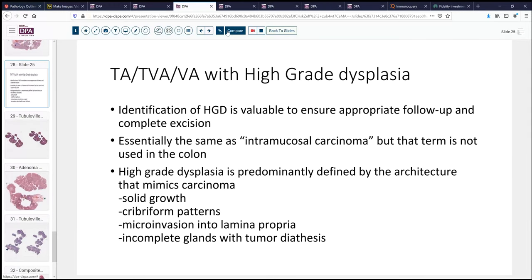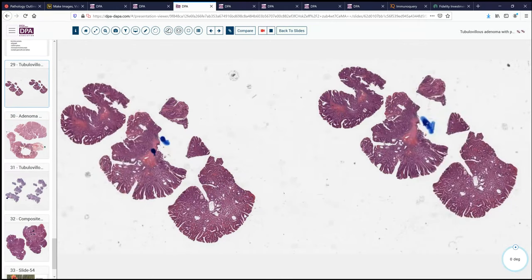Let's talk more about high-grade dysplasia. This is very important because we want to make sure we identify it and follow up so that the patient can get complete excision. This is essentially an equivalent term to intramucosal carcinoma — we use that term in the esophagus, but not typically in the colon. High-grade dysplasia is predominantly defined by the architecture, not by the nuclear features. It tends to have solid or cribriform growth patterns. It may have microinvasion into the lamina propria with small single cells, incomplete glands, and the presence of a tumor diathesis — luminal-type inflammatory and necrotic debris.